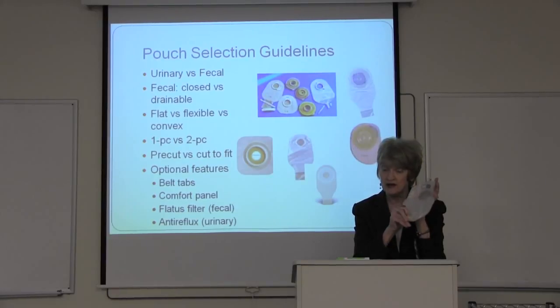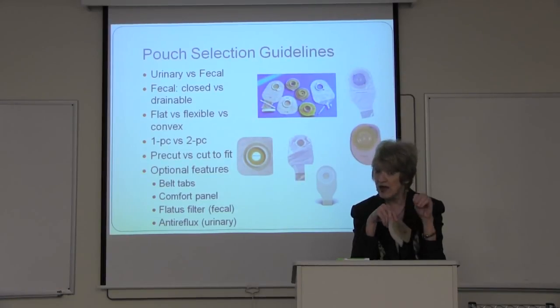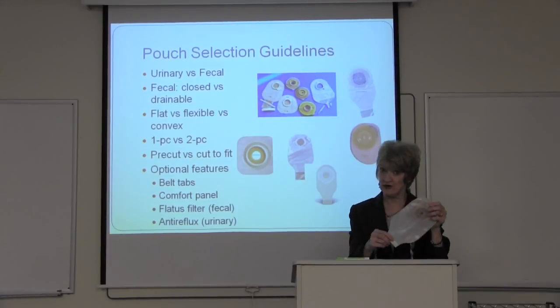I can sit right next to you and I won't smell the stool in your pouch any more than you smell the stool in my colon. Because you only have fecal odor when the odor molecule comes in contact with air. If my sphincter is closed, you don't smell my stool. If your pouch is closed, I don't smell your stool. So you want to make that very clear to them.